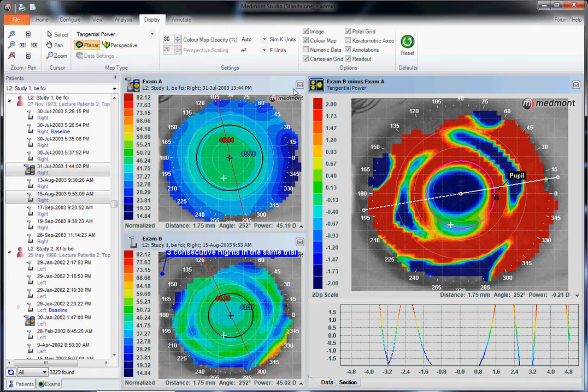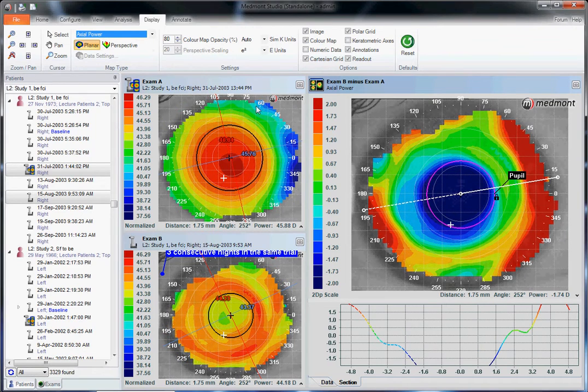So use the axial and the tangential map to determine refractive change, treatment zone position, treatment zone size, and tangential map for lens position.